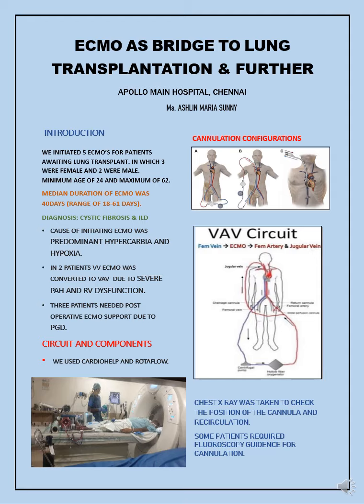Today I would like to share our experiences on ECMO as bridge to lung transplantation and further. Here we will emphasize newer technologies related to ECMO use before and after lung transplantation.